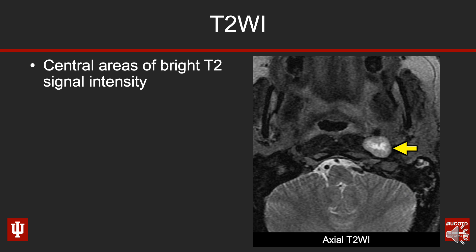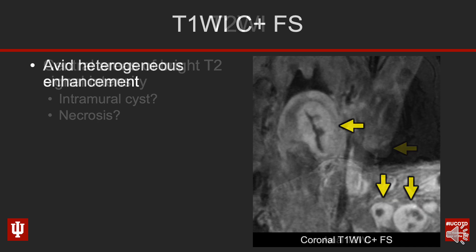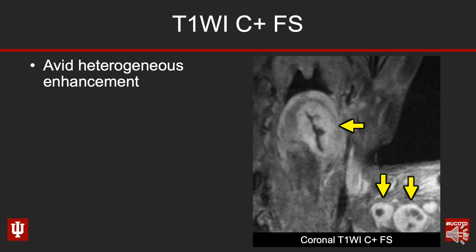Here's an axial T2-weighted image through the level of the nasopharynx, looking in cross-section at that T2-bright mass in the carotid space. Predominantly this mass is T2-bright, but internally right in the middle there is a very bright central region. When you see this kind of pattern, you wonder: am I dealing with an intramural cyst like in a schwannoma, or is this potentially necrosis like you might see in something more aggressive?